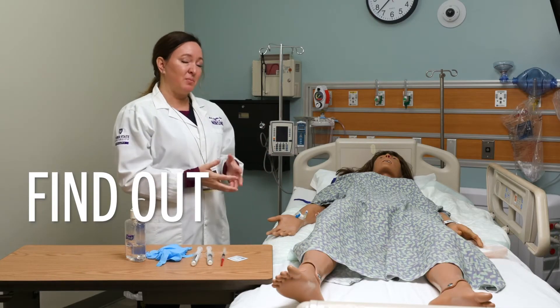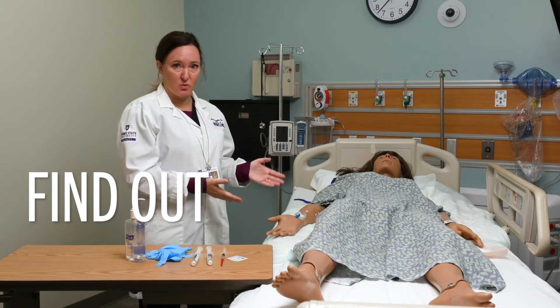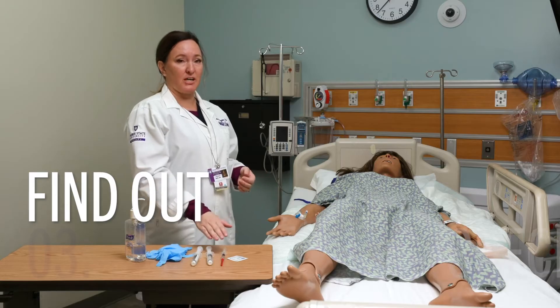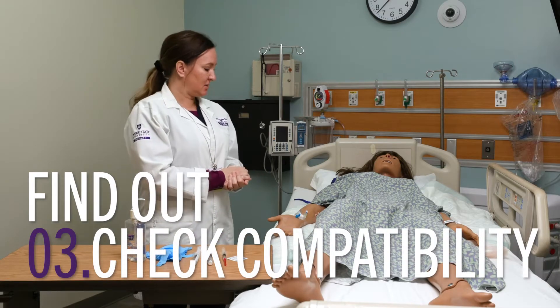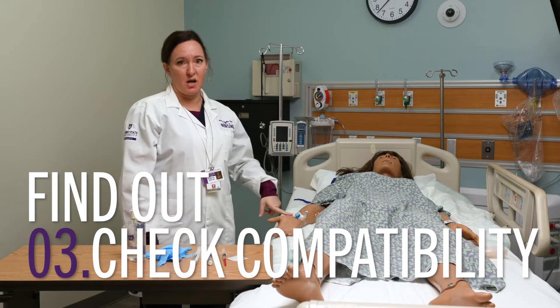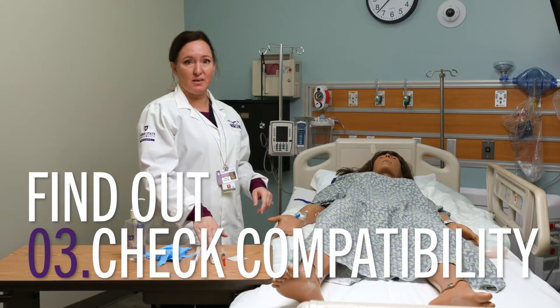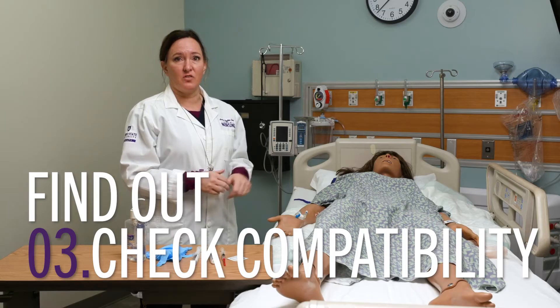If you are giving a medication in addition to a fluid or a medication that's already running, then make sure you check compatibility. In this case, we are just using an NS lock, and so as long as my medication is compatible with normal saline that I'm pushing before and after, then I am good to go.